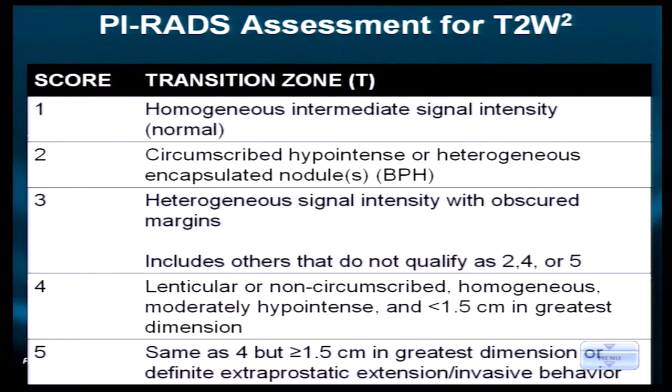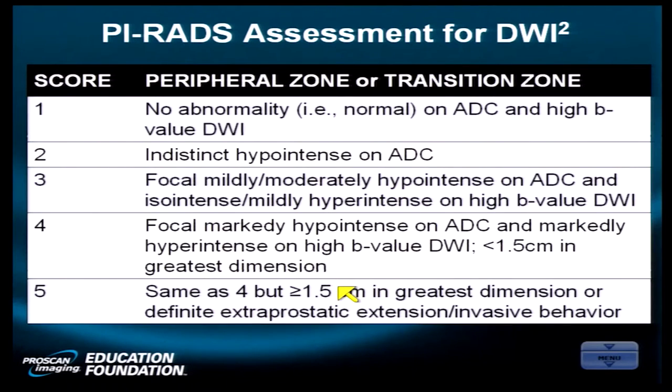But you just saw an example of a patient that had involvement in the central region of the prostate gland where there was a very lenticular-shaped area, especially as we got down low in the last vignette. As we got down low, you saw lenticular involvement and erasure of the entire anatomy, both the central anatomy, the surgical capsule, and even the peripheral zone. So all of them were completely wiped away. That makes the diagnosis of PI-RADS 4 in the transitional zone and central region a lot easier. And then PI-RADS 5, same thing, except you have size.